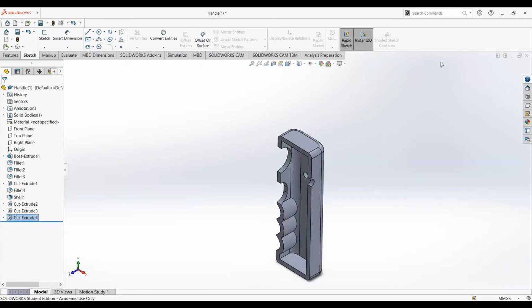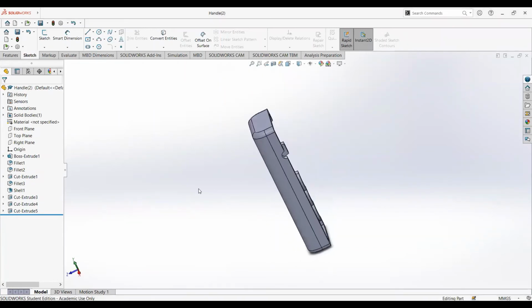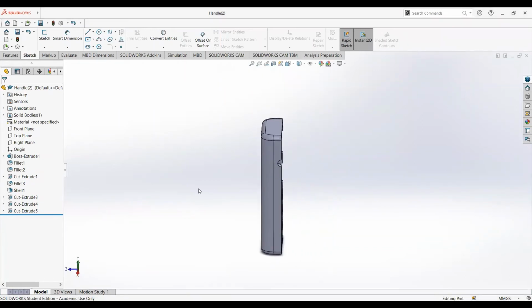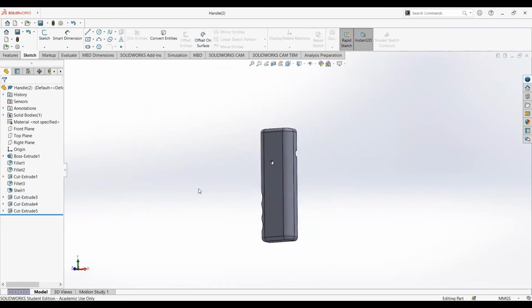Let me show you the other side of it. So this is the other side of it. We just used a different plane, and all the dimensions and all the steps are similar. I'm just showing you how it looks. So yeah, let's move on to another part.